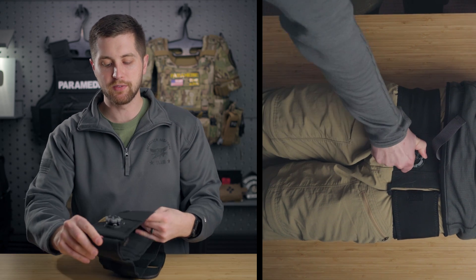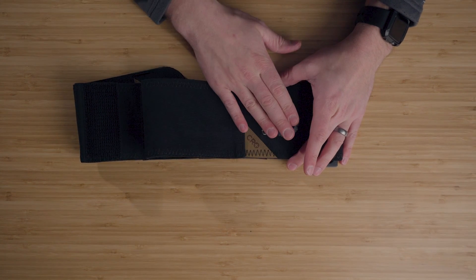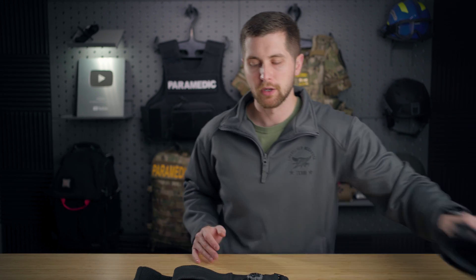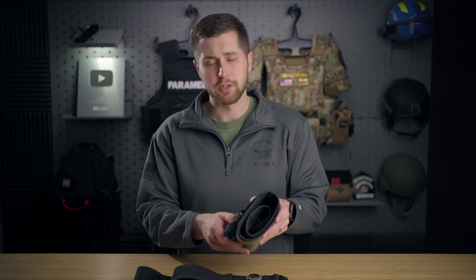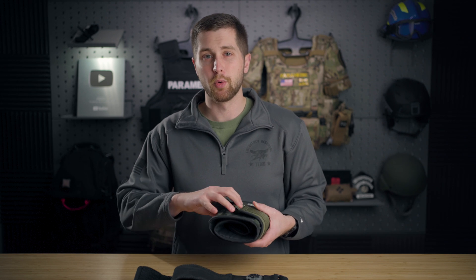This brings me to the technology of this and one of the other reasons I like it over the Sam Pelvic Sling. This BOA binding here can tighten up to 80 pounds of force. We know that to successfully reduce a pelvic fracture you need to have at least 33 pounds of force. However, there's been no max limit to that — nothing that shows any harm if you tighten above 33 pounds. The Sam Pelvic Binder is meant to click into place when you hit the minimum 33 pounds, which is great most of the time. However, there are situations where you might not get it tightened all the way, or you might catch something and it deploys before you actually get to that force, and there's really no way of knowing or troubleshooting that.